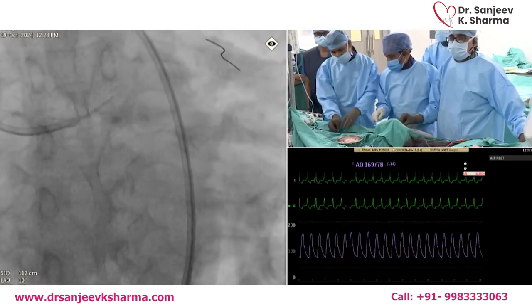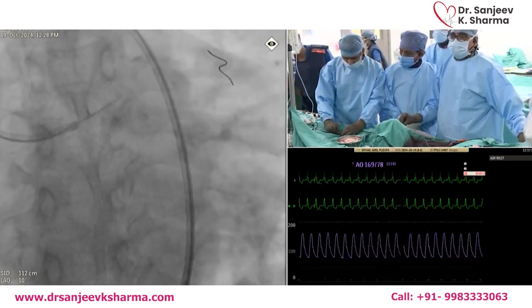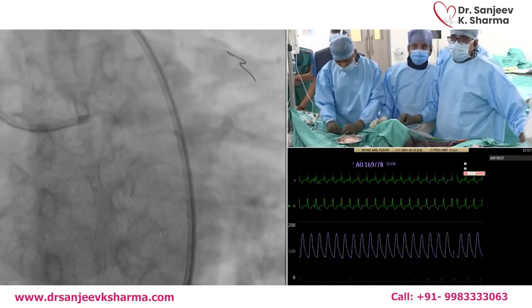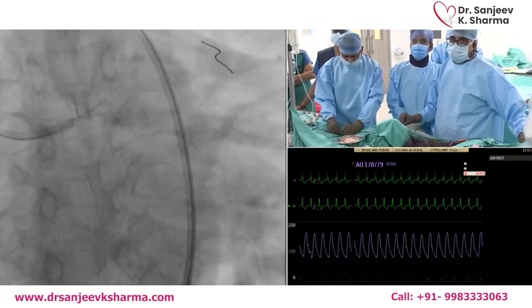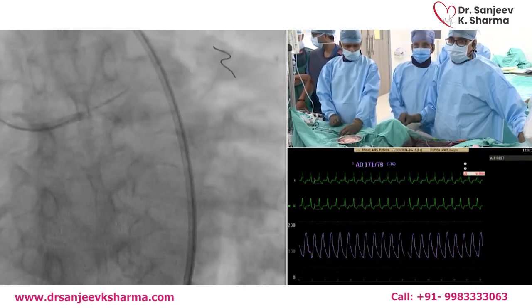At what vessel size do you go at high speed? Not 3 or below, right? It has to be 3.5. Definitely I would not say below 3.5, something like that, maybe on the way back. Any other comment? So do you start with a 120 speed? No, first 80. First 80, and then it has to be 85. First start with 80, all the way 80. Be very happy with the 80.